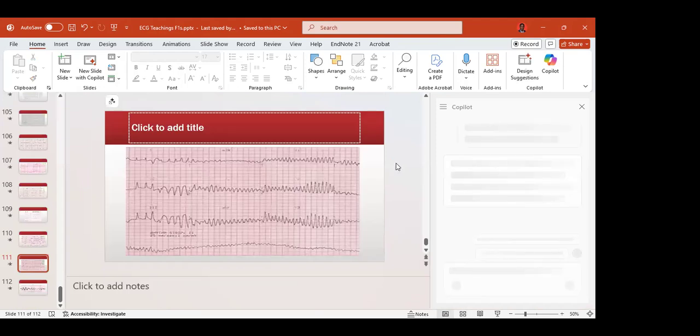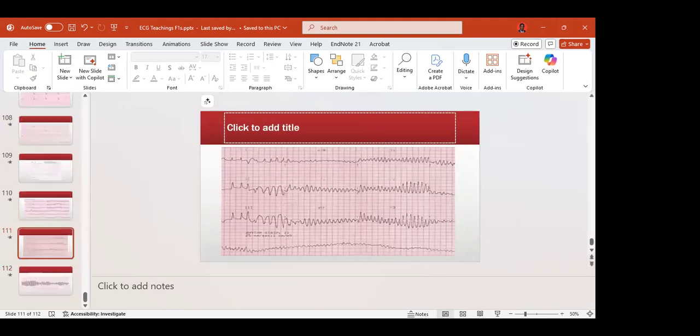Sir, in the exams, are you supposed to know everything in the ECG? Some ECGs can have five issues to recognize. Must you know all five? Like an ECG that has ST elevation, the same ECG can also have other findings. I think I understand exactly what you're trying to say.